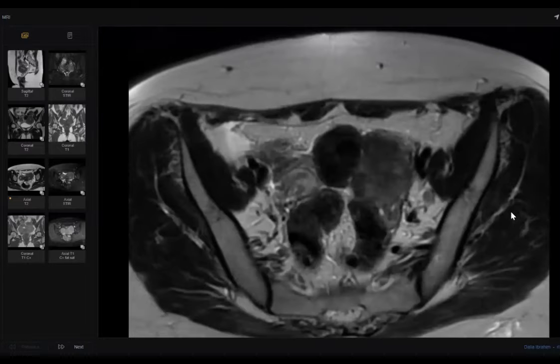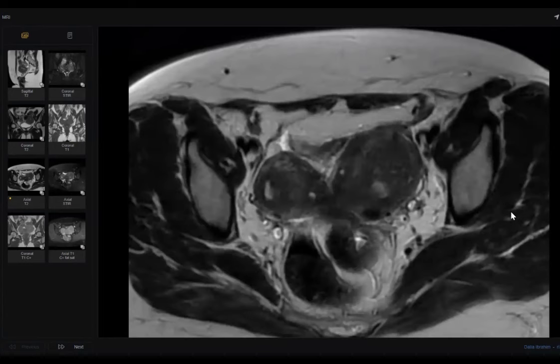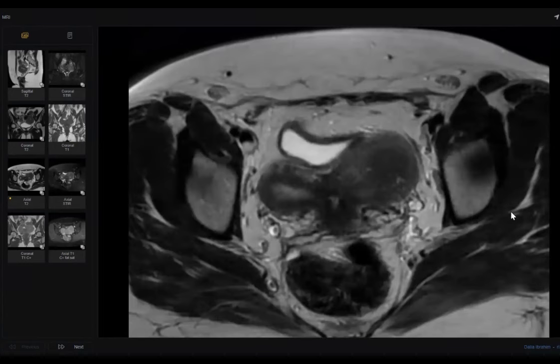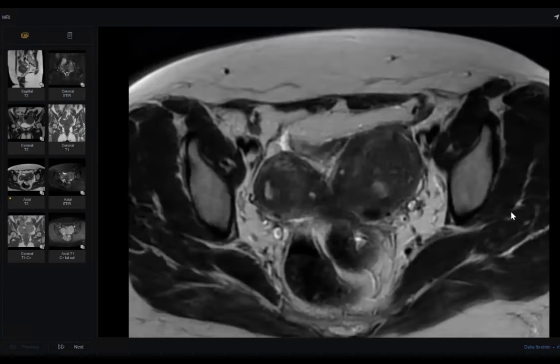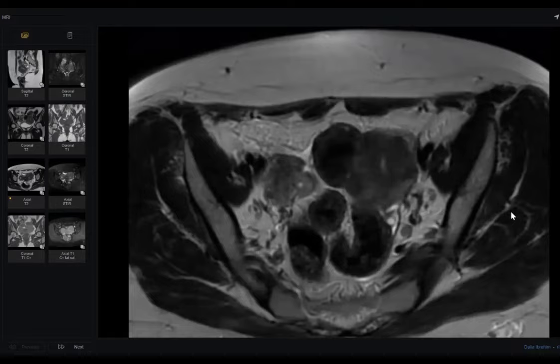So at one of the corners, there is thickening here, like thickening of the, is it fibroids? I'm not sure. The myometrium is thickened. The transitional zone is thickened.